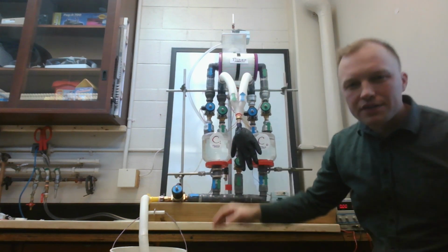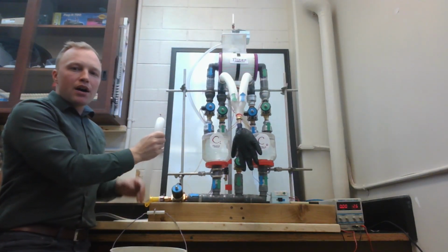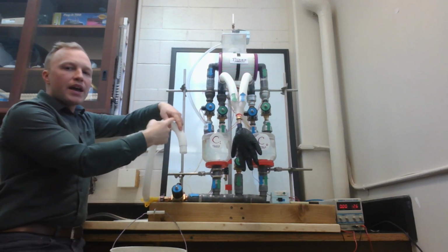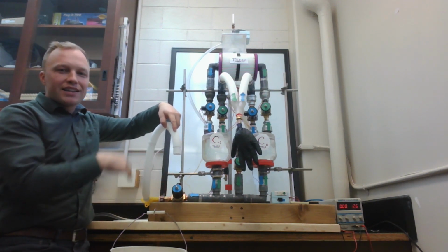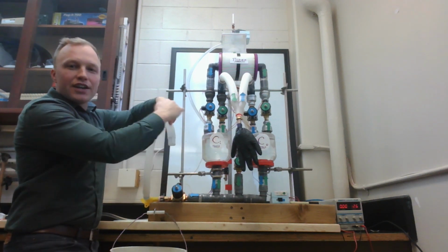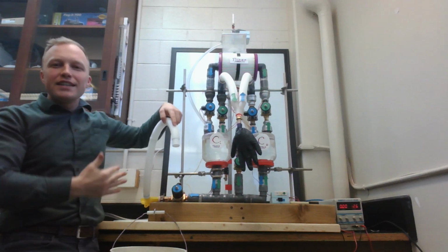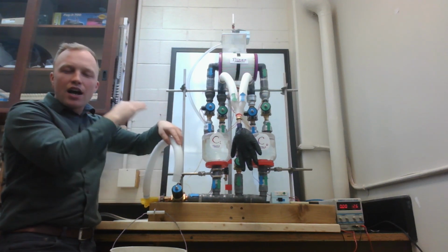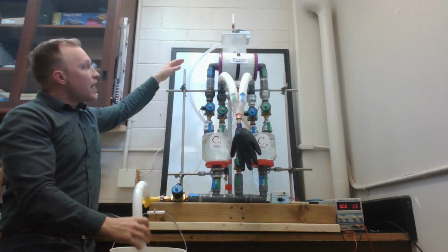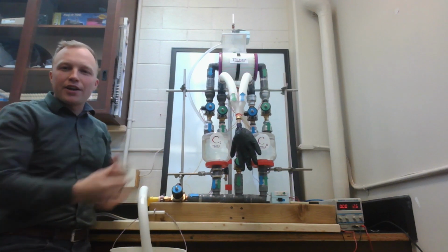in the cylinders. But if you simply move the drain up to being above the water level in the cylinders, now water has to travel up and over to leave the system. And that means that these cylinders are now actually under pressure from the water height in the tube. This allows you to easily create a smooth transition of the expiratory pressure to the lung, and also provide a variable pressure on the inhale.